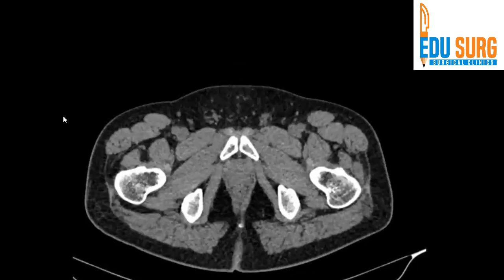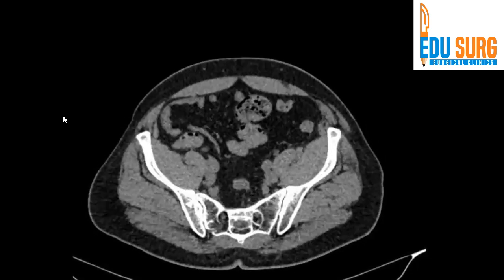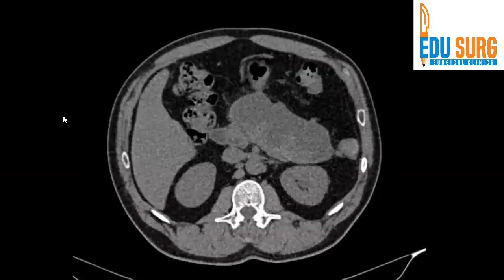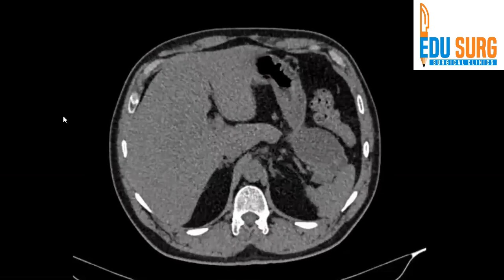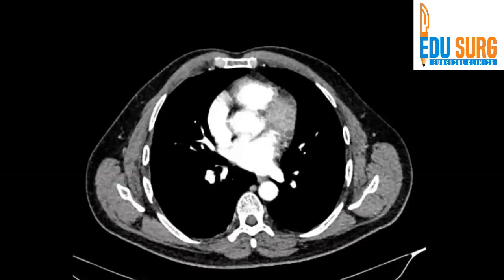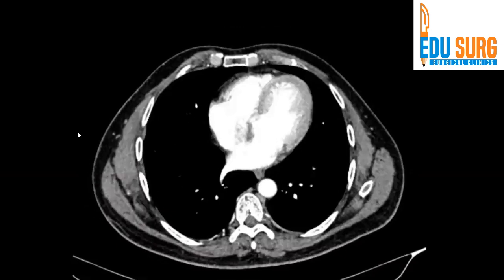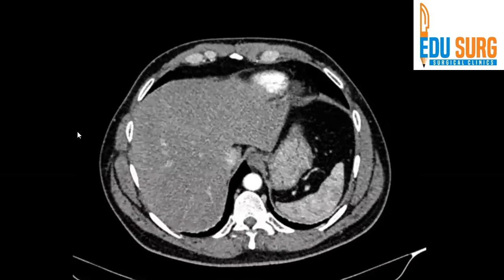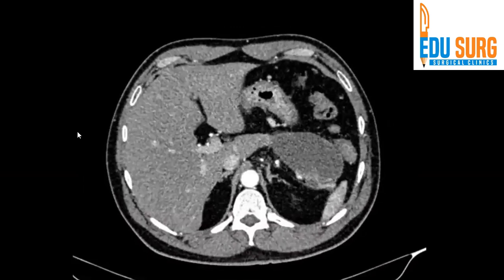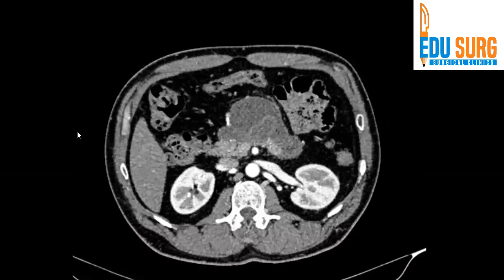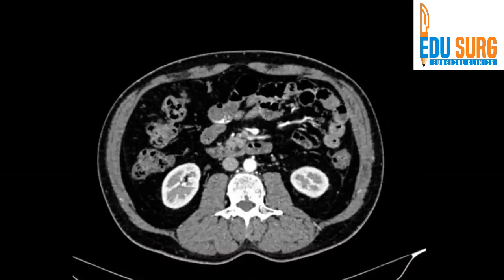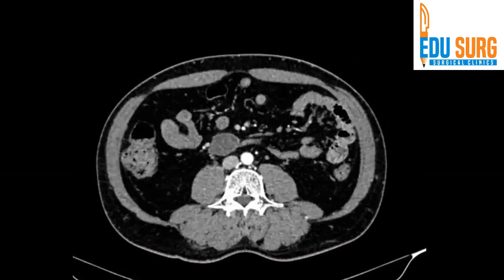Fairly simple case this one. There are two or three important findings that we are going to discuss. I will give a brief history when I start discussing the case, but before that just have a look at the phases and try to identify the phase. Don't focus only on the pathology — you have to look at the entire scan.